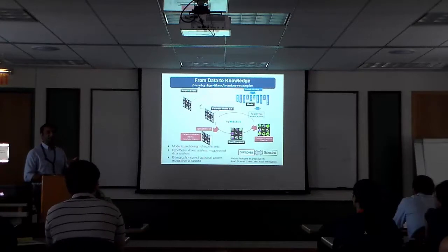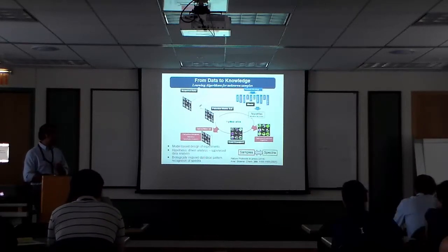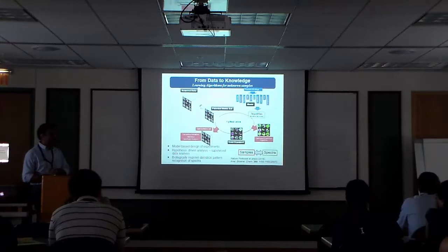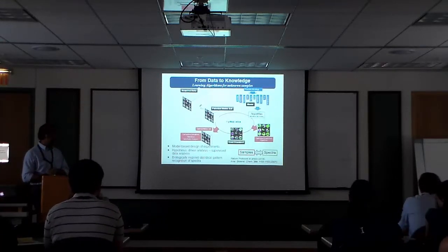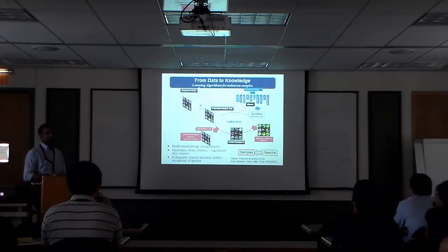Then we do a statistical pattern recognition approach, where we do a purely signal processing approach and say, if I were to take one feature, how well would it classify something that I decided was my model, and how well did it compare against the gold standard, right? So we mark off a few pixels every sample, and we say, we predict the whole thing, and how did this compare with this, right? If it compared well, based on the statistics, we say, well, that feature is useful, let's keep it, right? And then we go through and do this one at a time.